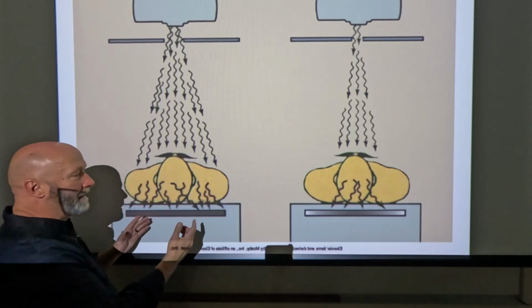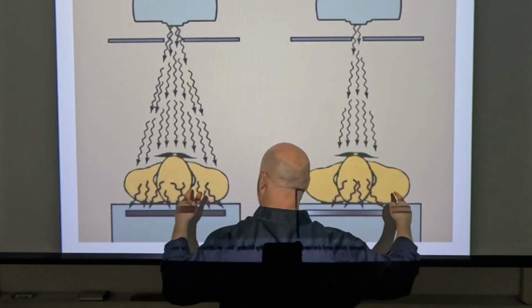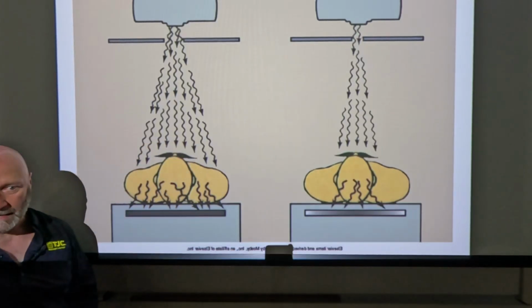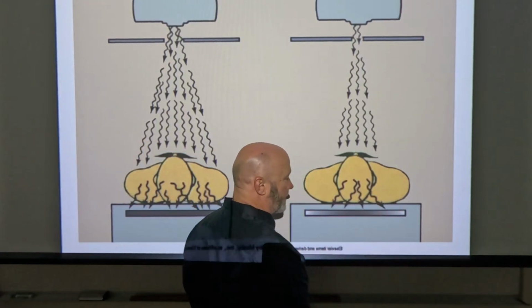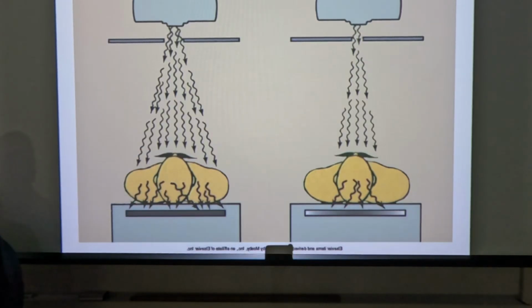So now let's apply this. A photon that's created over here, and in this drawing is going out this way. What happens if it goes that way? Does it add to the image? The answer is yeah. So if we collimate in and collimate that photon off, that would be created out here and hit the image receptor, what happens to our image receptor exposure? We eliminated some of those photons. So your image receptor exposure goes down. Yeah, it goes down.